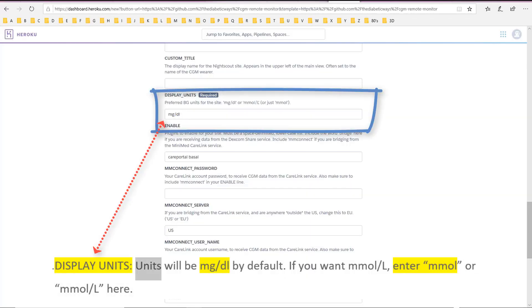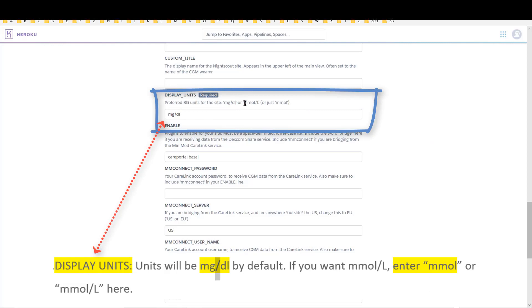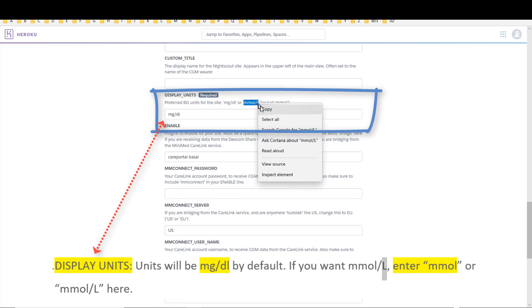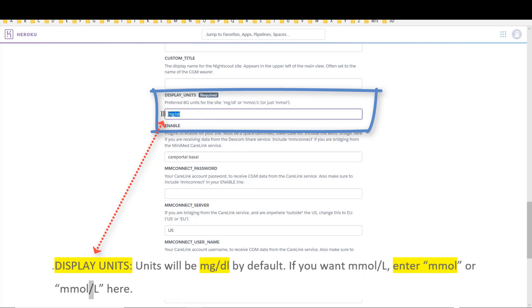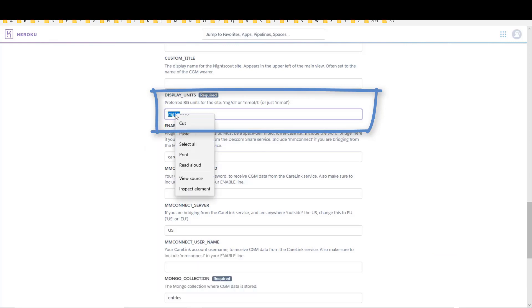Display units: units will be MG/DL by default. If you want mmol/L, enter mmol or mmol/L here.